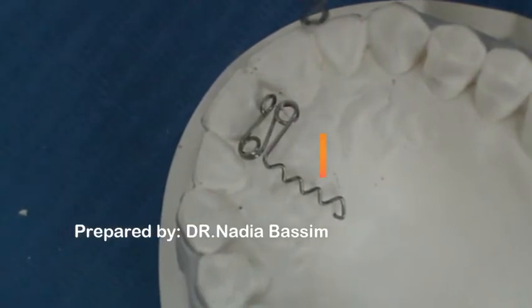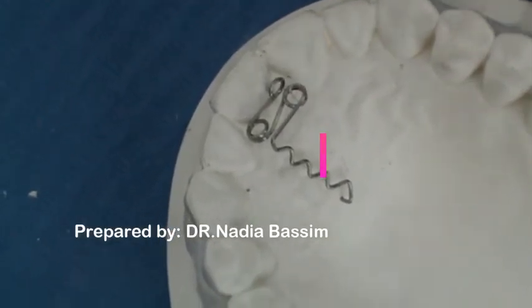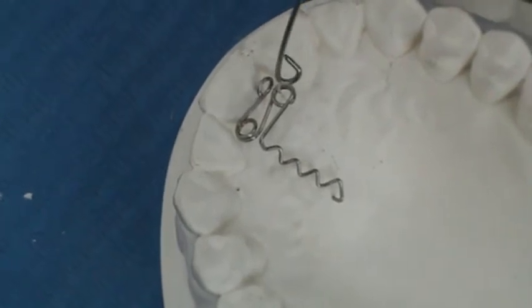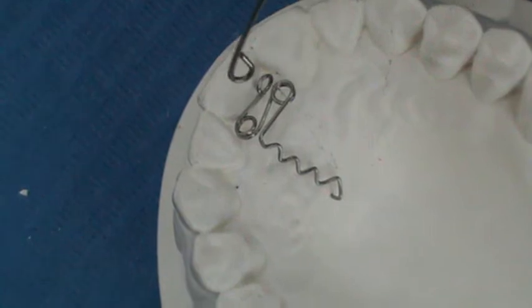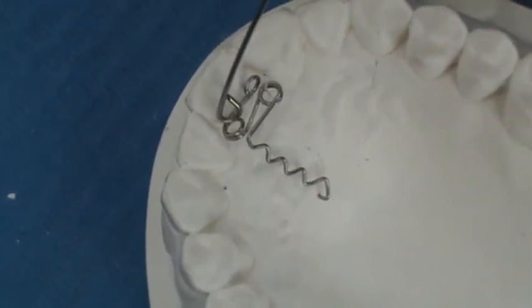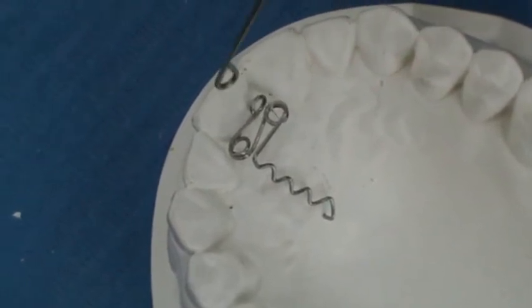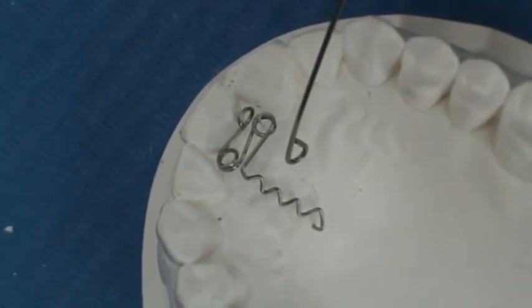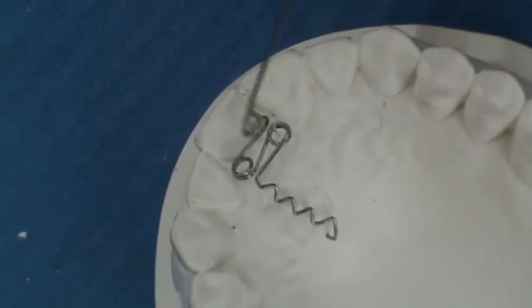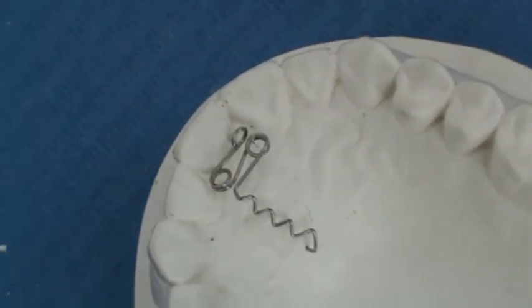So this is the completed Z-spring. This is the atraumatic end, directed mesially as described, and these are the two coils — both two to three millimeters in diameter. The first one is directed downward and the second one upward, and we have three equal arms. The first arm should lie on the cingulum of the tooth, and the whole spring should be perpendicular to the palatal surface of the tooth.